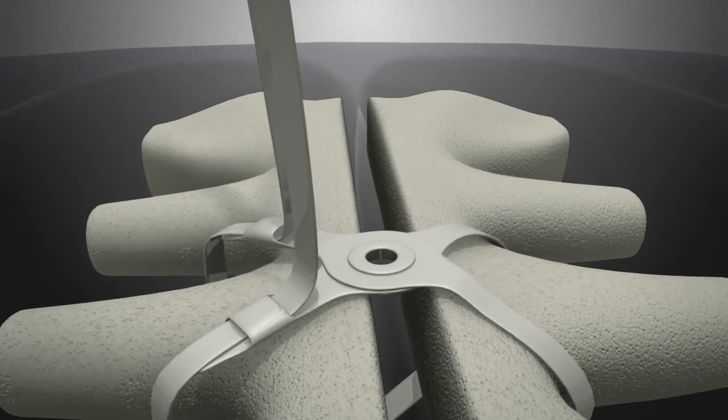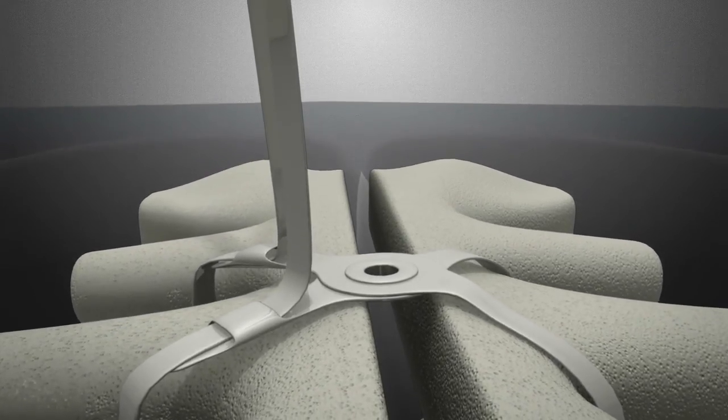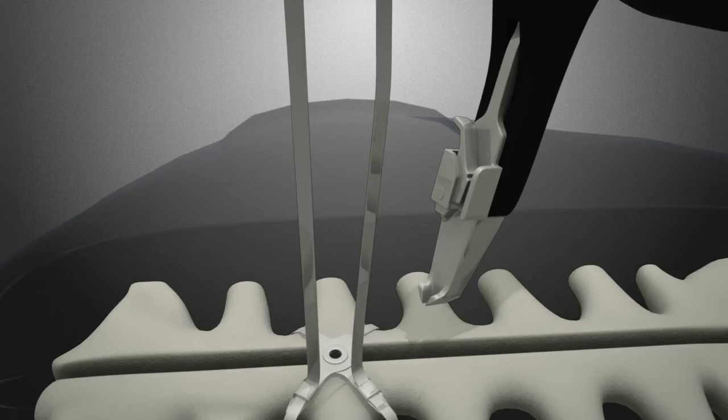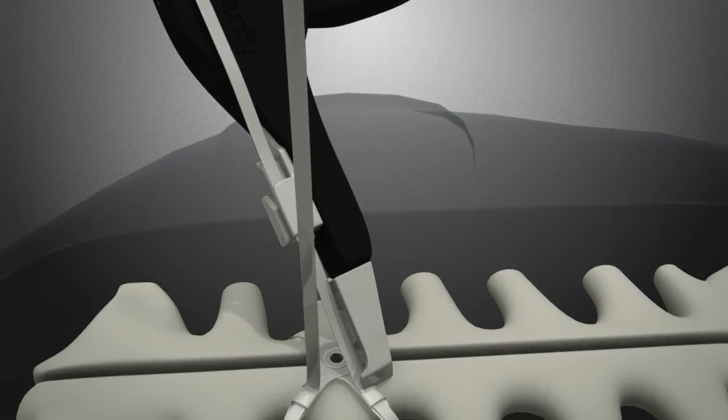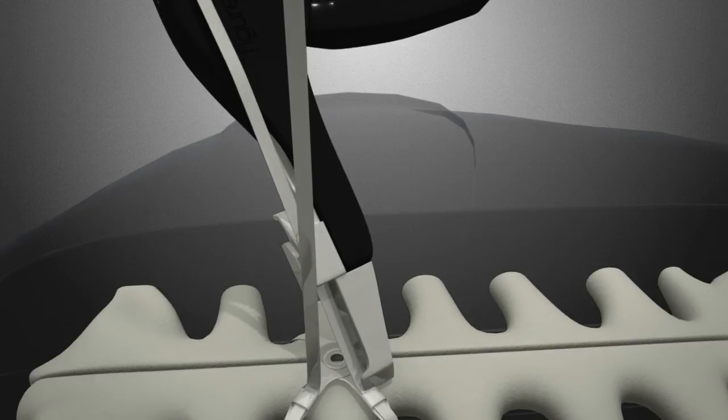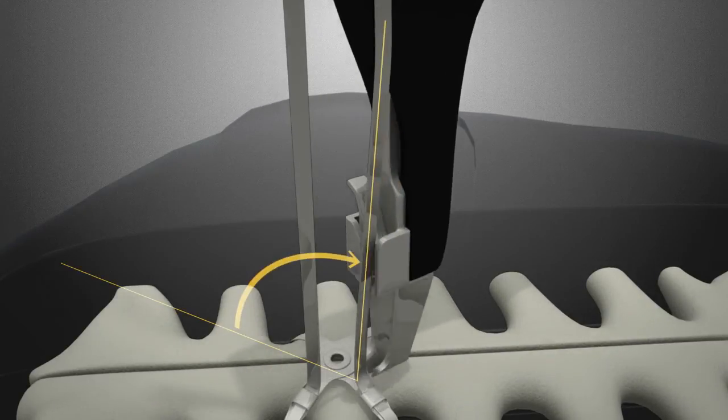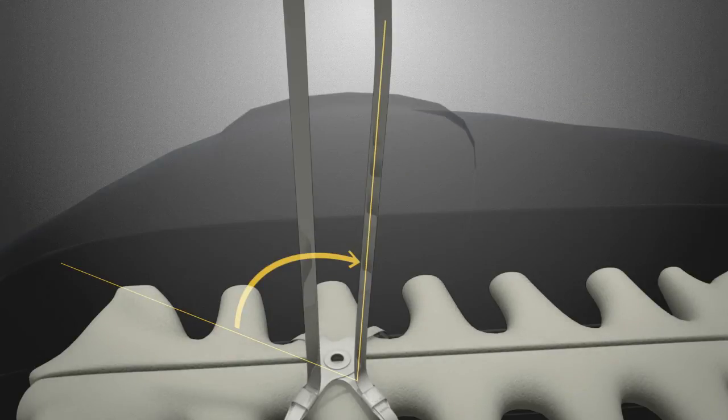Attention is then given to the manubrium where the Figure 8 devices are tightened. On these devices, you may tighten them to the desired position and final tightness. Once you have reached approximation of the sternal halves, the strap is bent to 90 degrees and left alone until all straps have been tightened.